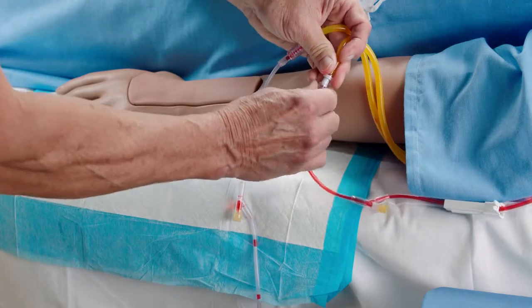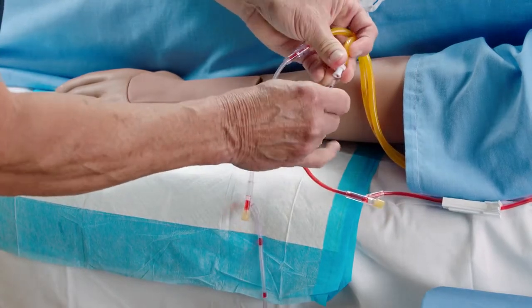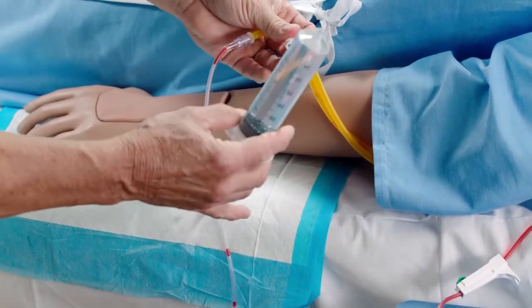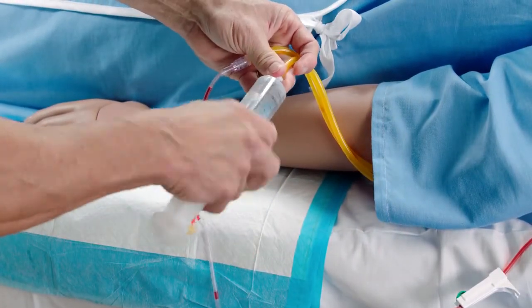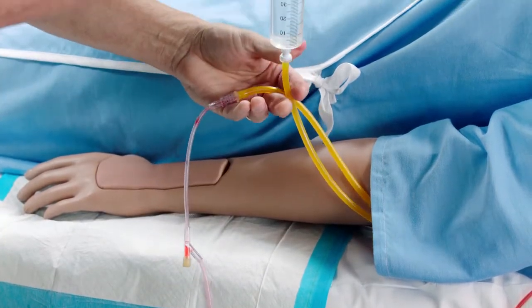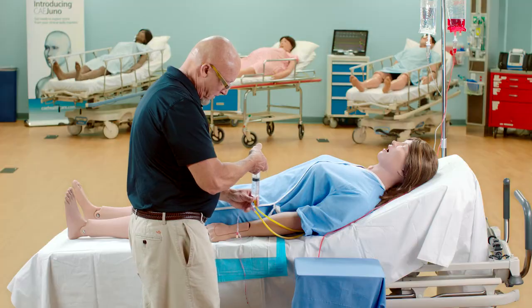If you used simulated blood, we recommend flushing the tubes using a syringe filled with clear distilled water. Disconnect the IV tubing from the IV prime port, attach a syringe filled with clear distilled water to the appropriate IV prime port, and infuse until clear fluid is coming from the IV drain tubing.